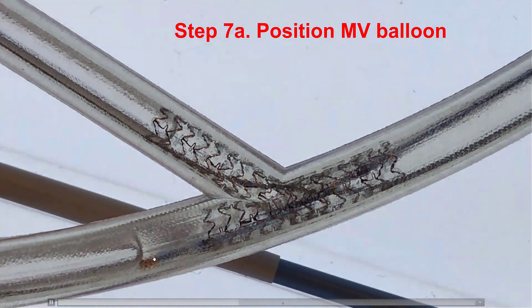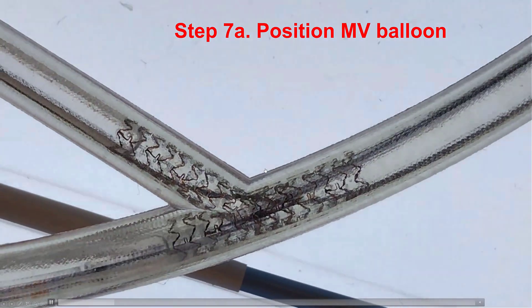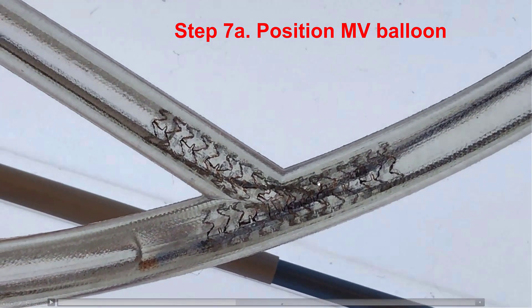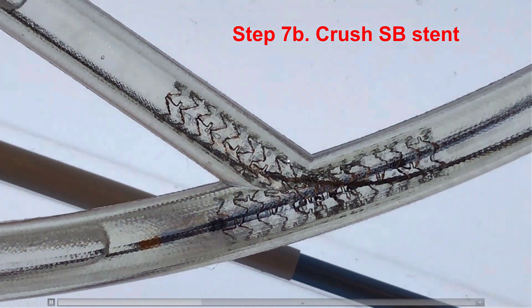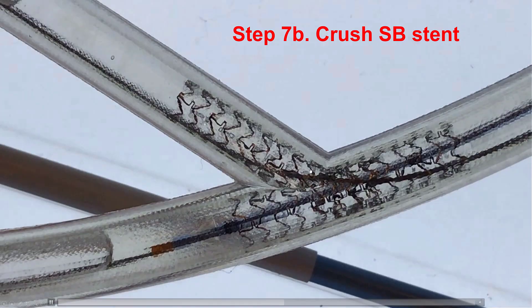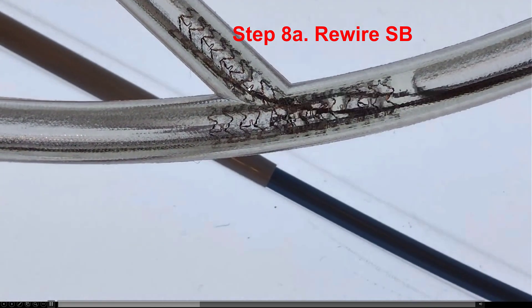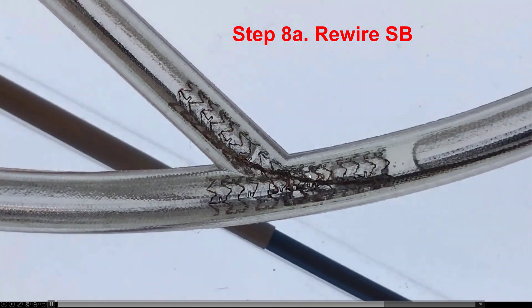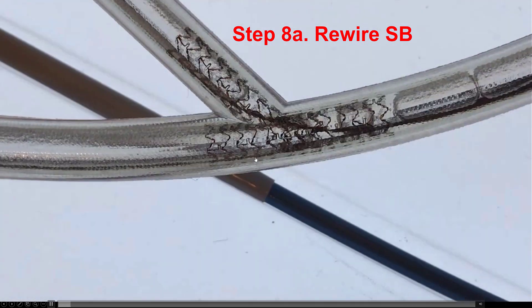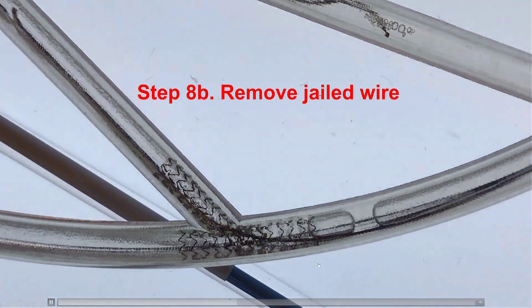The next step is to pull back the balloon which had been placed into the main vessel, going over the segment of the side branch stent that is protruding into the main vessel, and then this balloon is inflated, essentially crushing the portion of the side branch stent that is protruding back into the main vessel. After this is done, we now have another jailed wire. The side branch wire is jailed one more time, so we use another wire to wire through the side branch, and then we remove the jailed wire after rewiring has been accomplished.